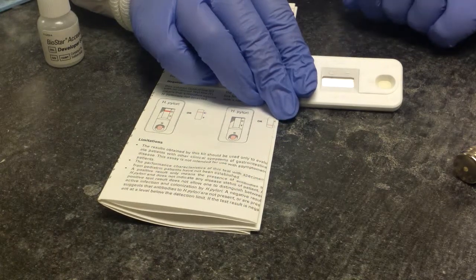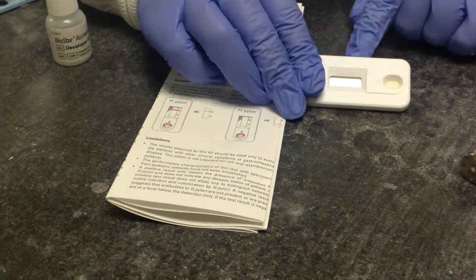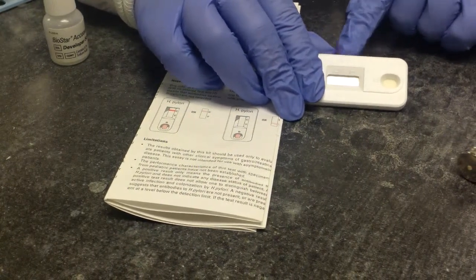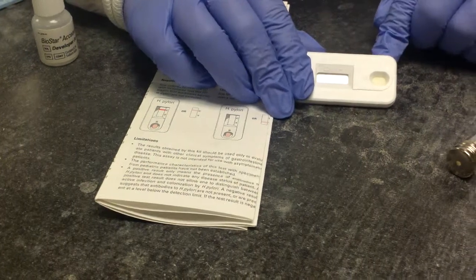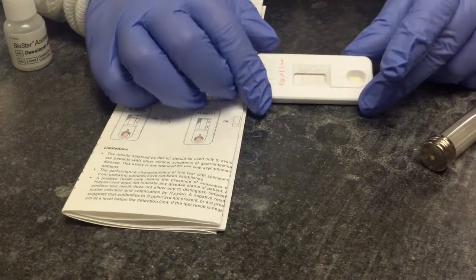We would read our actual patient 10 minutes after we've started. Always make sure you know the maximum time, because after 20 minutes, this test is no longer valid. You have to start all over. So make sure you read the package insert carefully.